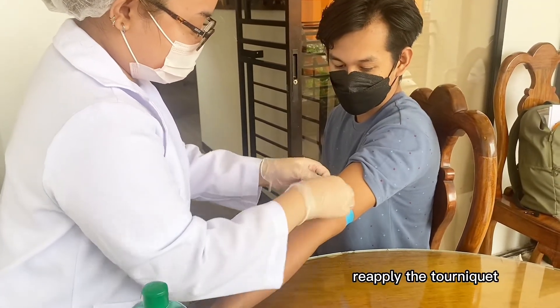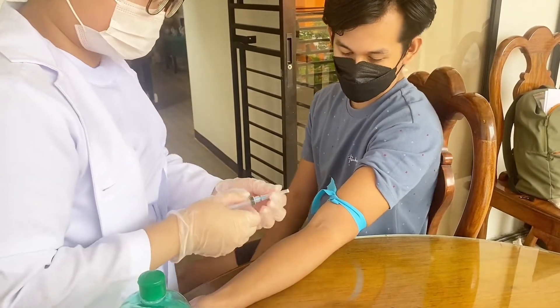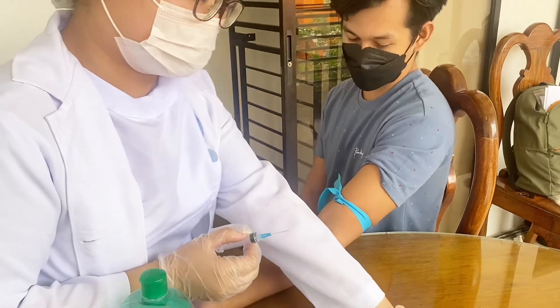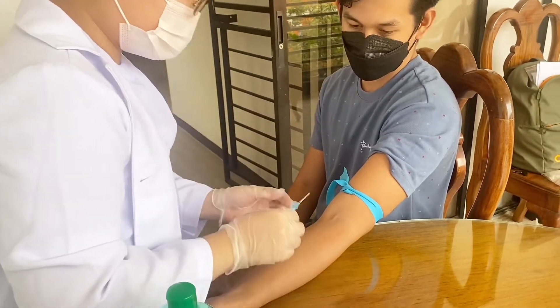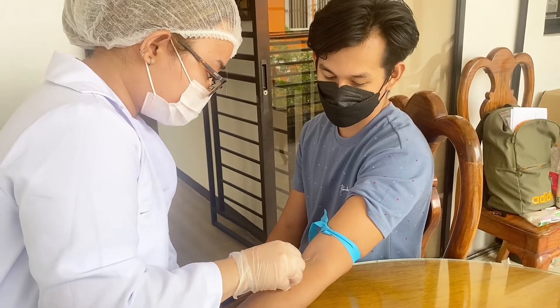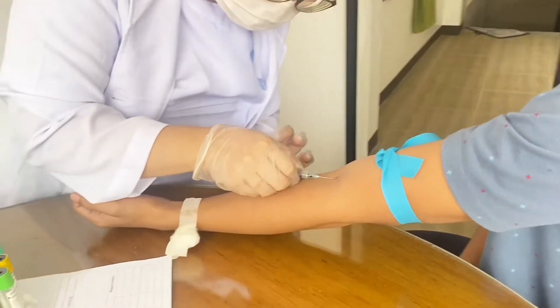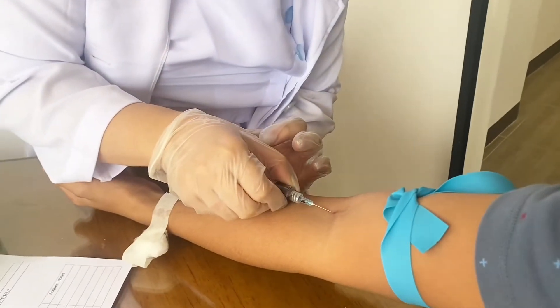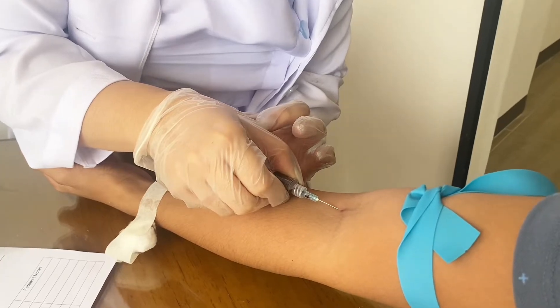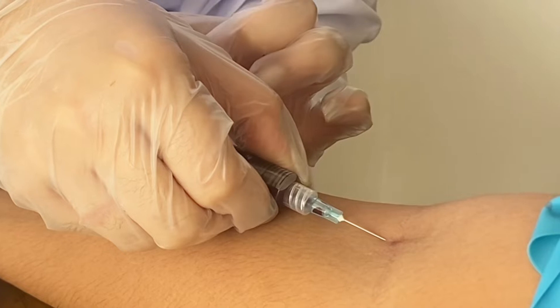Reapply the tourniquet and then perform the venipuncture. Anchor the vein by holding the patient's arm and placing a thumb below the venipuncture site. Ask the patient to form a fist so the veins are more prominent. Enter the vein swiftly at a 30 degree angle or less and continue to introduce the needle along the vein at the easiest angle of entry.